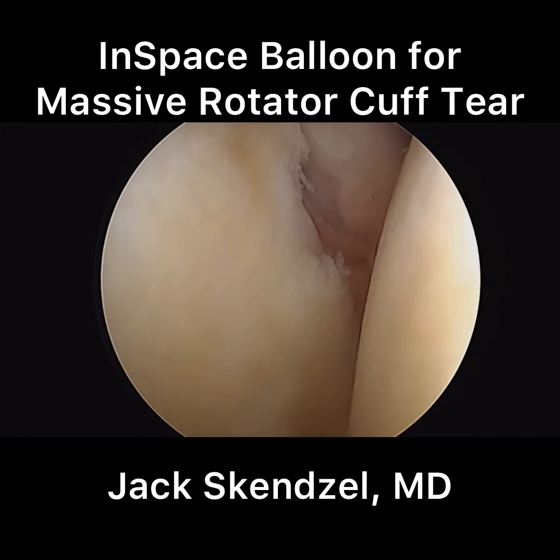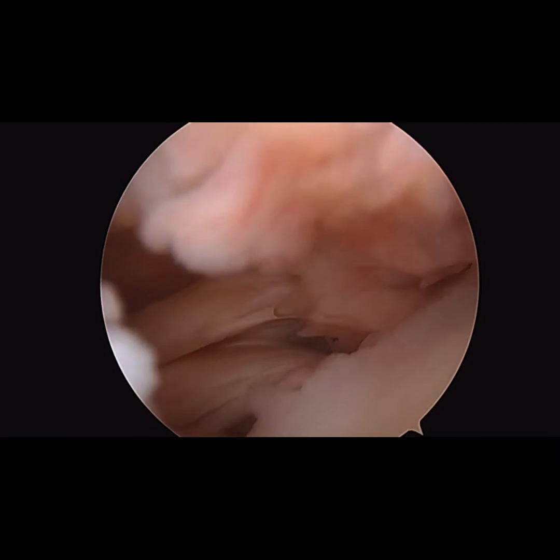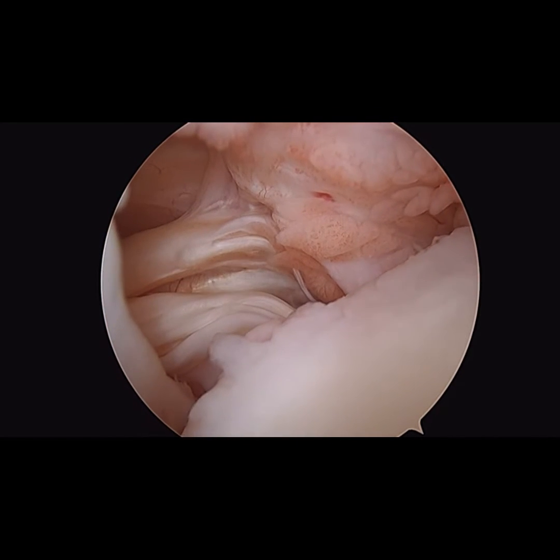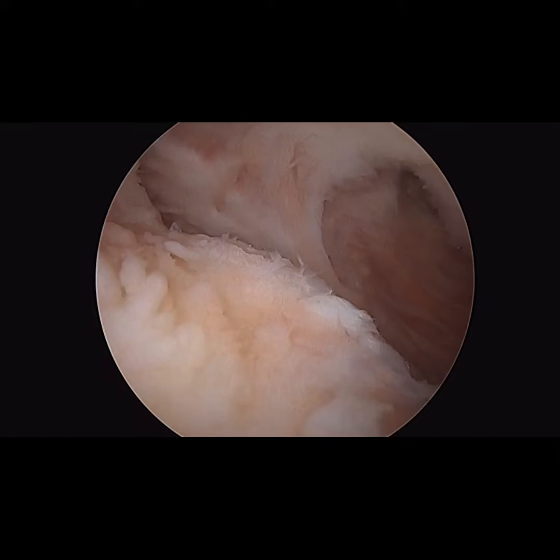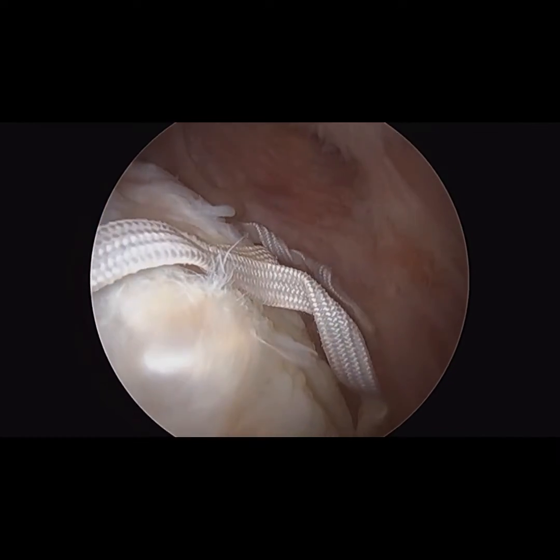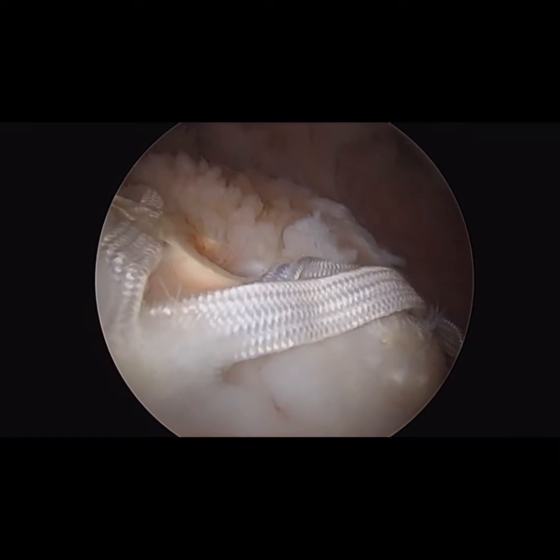This is the video of a 75-year-old female without osteoarthritis who sustained a recurrent rotator cuff tear. She had an intrasubstance split of the subscapularis tendon, but otherwise it was intact. The footprint is completely devoid of any rotator cuff attachment. You can see previous suture and anchors from the prior repair, which had completely failed.